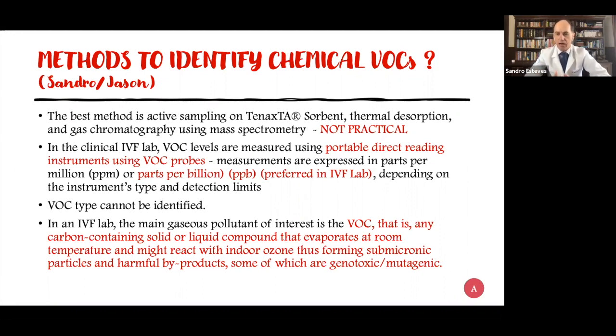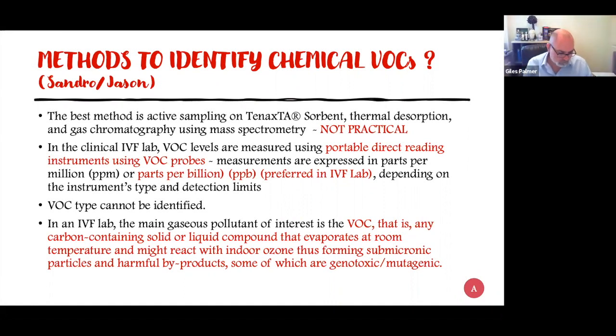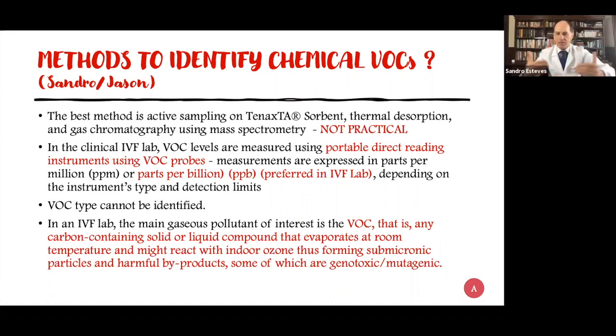So one way we have to dilute the contamination in the lab is having positive pressure. When you install a unit inside your lab and still don't have positive pressure, it's not enough, to my understanding, because obviously you are making the air better quality, but you are not completely avoiding bringing contamination in because you don't have positive pressure.